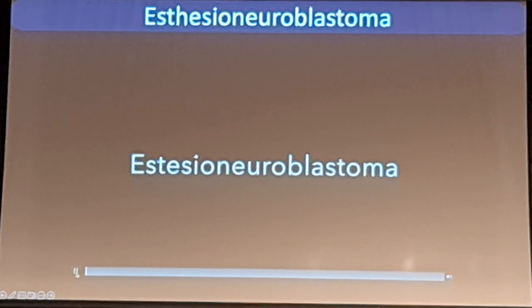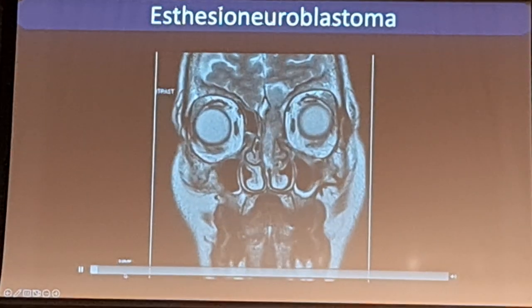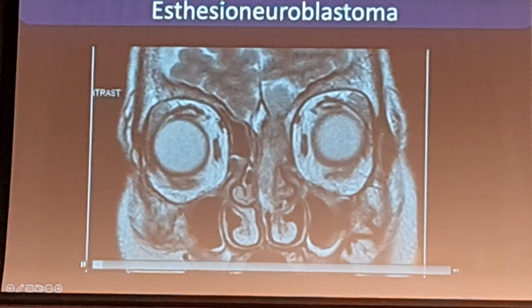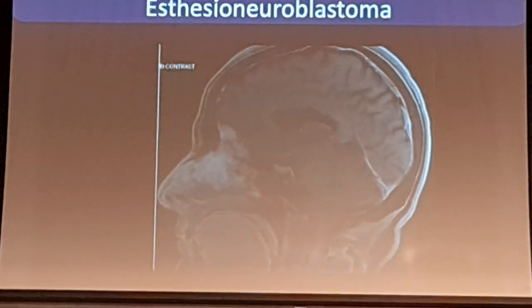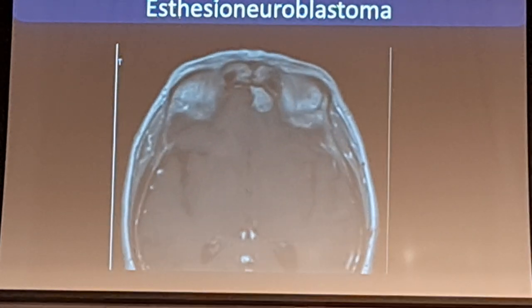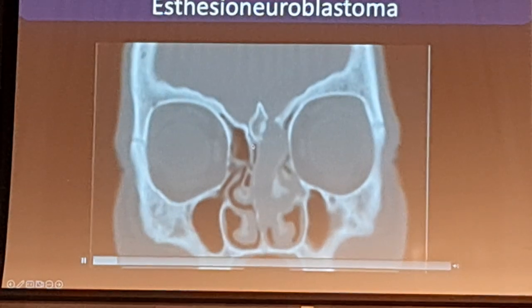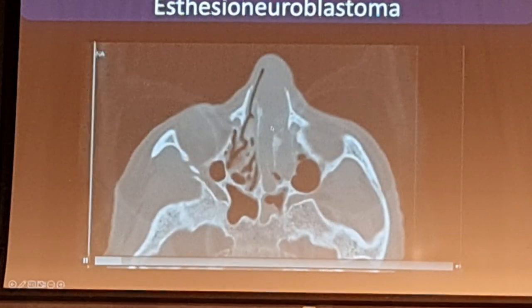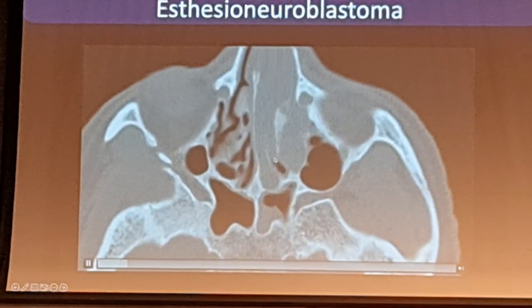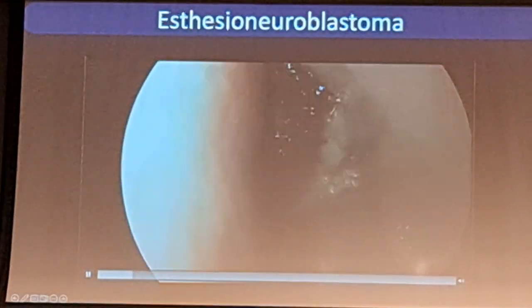Another case. I tailor the approach depending on the space and the size of the tumor. They take into account the oncological concept. You see this is a unilateral one, so I try to remove everything from the left side. This is the tumor.